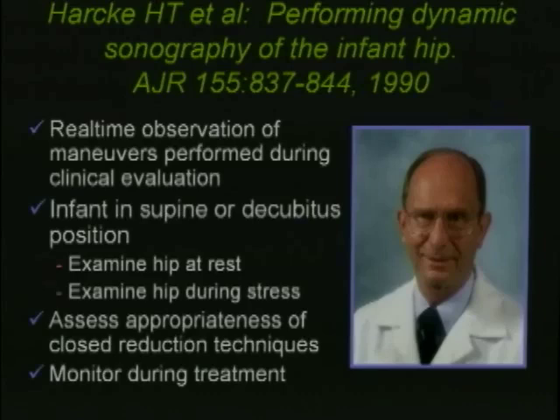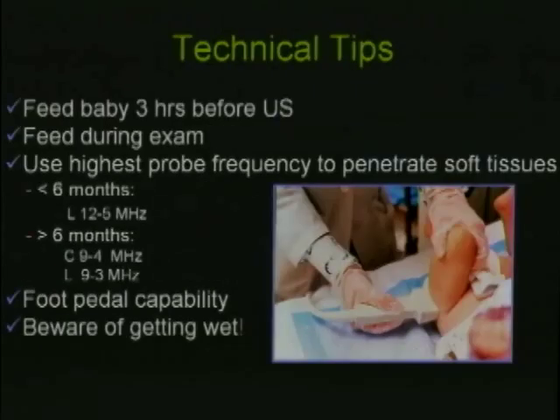The baby is in a supine or a slight decubitus position, and during dynamic hip sonography, we are examining the hip at rest and during stress. It's a great way to assess the appropriateness of closed reduction techniques and to monitor the hips during treatment.